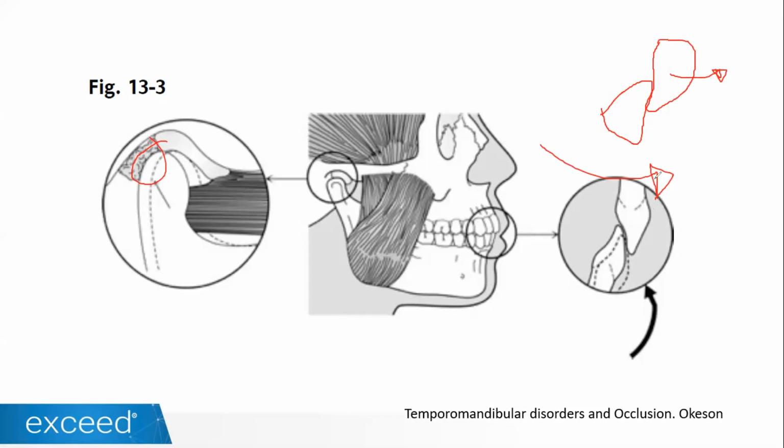And you see those patients 4 or 5 months later, and they are almost full class one. This is because that mandible is actually trying to go forward, but it cannot go forward because it is trapped. So this is actually a benefit for us, but for patients that have a really tight overjet, those pseudo class three patients normally are going to be biting like this.